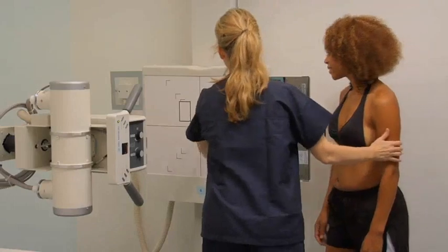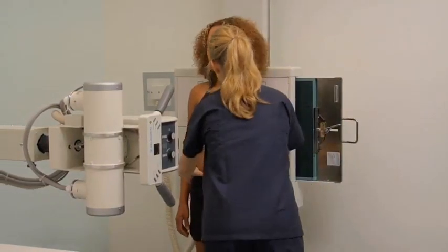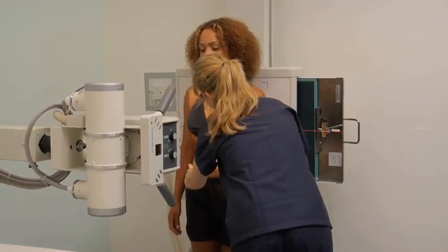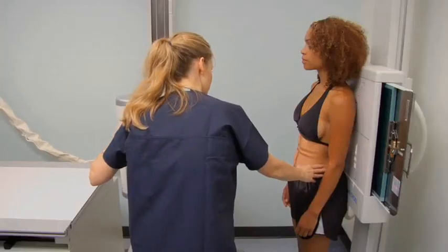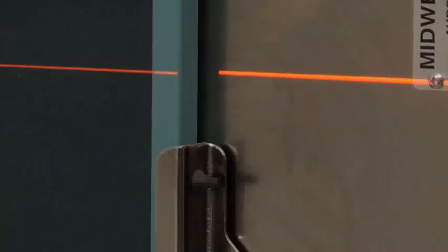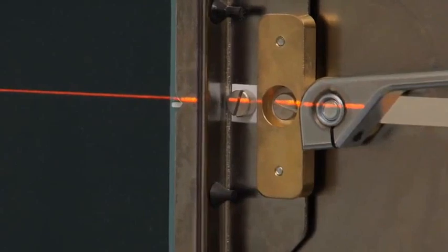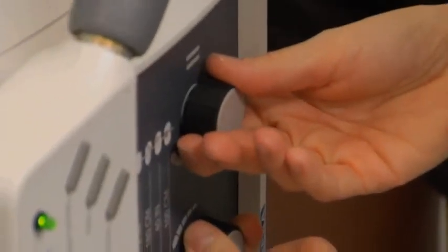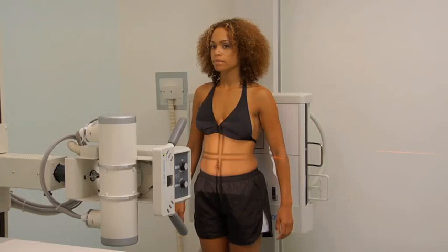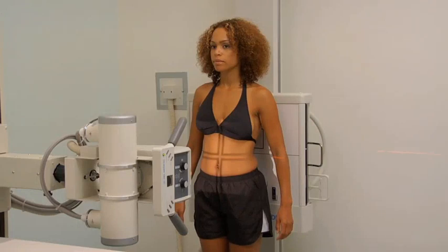Ask the patient to stand with their back against the upright bucky and move their arms slightly away from their body. Direct the central ray to the midline of the abdomen, two inches above the iliac crests. Align the image receptor with the central ray. Collimate the light field on all four sides to include the diaphragm, lower ribs, lower abdomen, and lateral soft tissue borders of the abdomen.